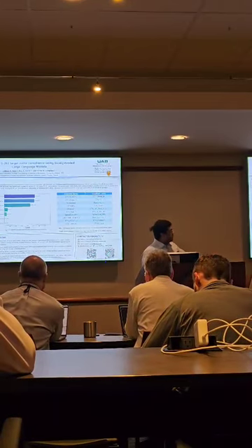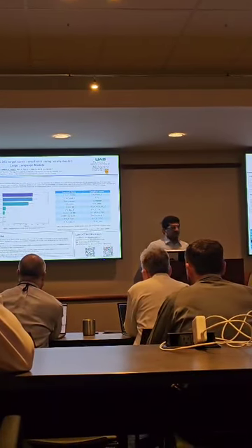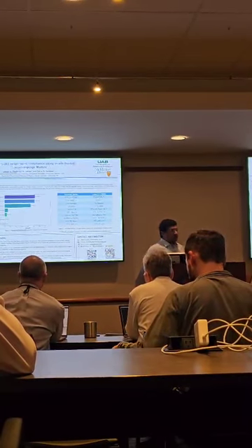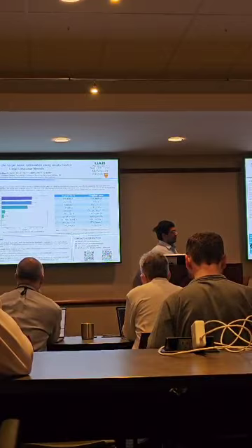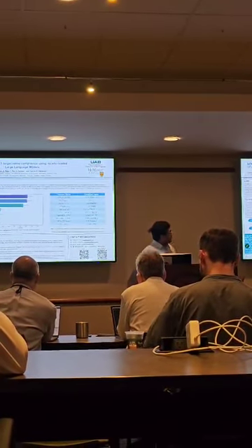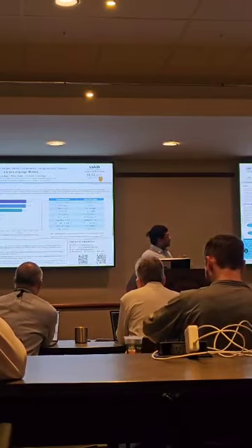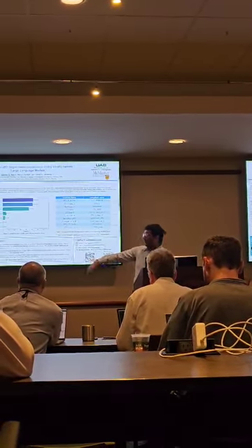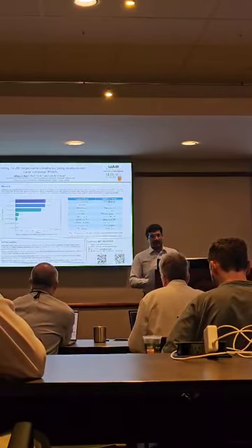And once we have this big list of qualities about that initial incorrect name, but now obviously corrected, we can pass that through to the validator that Drew was presenting earlier, that Dr. Cardenas built. And what that allows us to do, using that backend, is generate a TG263 compliant name. So you can always go from an incorrect name to a compliant name.